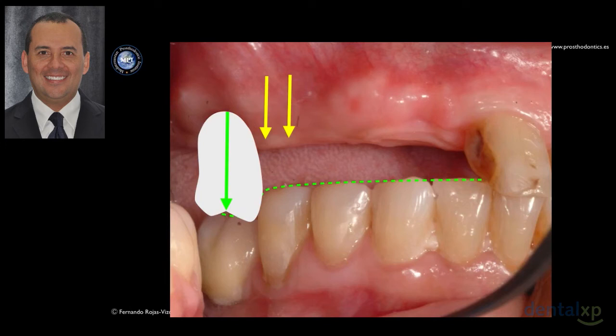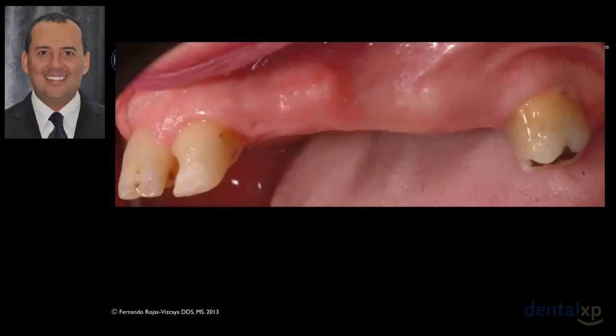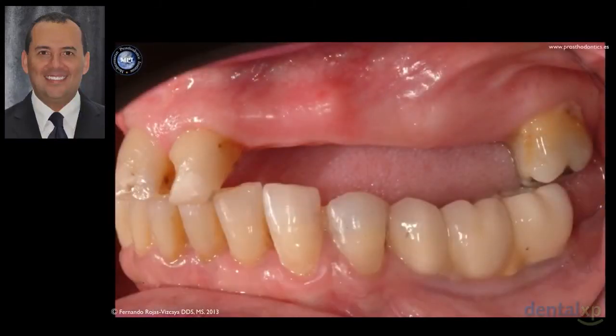And when we are speaking about aesthetics, 1 millimeter or 2 is a big difference. Imagine that you have one lateral 1 or 2 millimeters longer or shorter than the other side. You compromise the aesthetics. And on the other side, take a look at the position of the occlusal plane. This is maybe because of the lower fixed restoration.